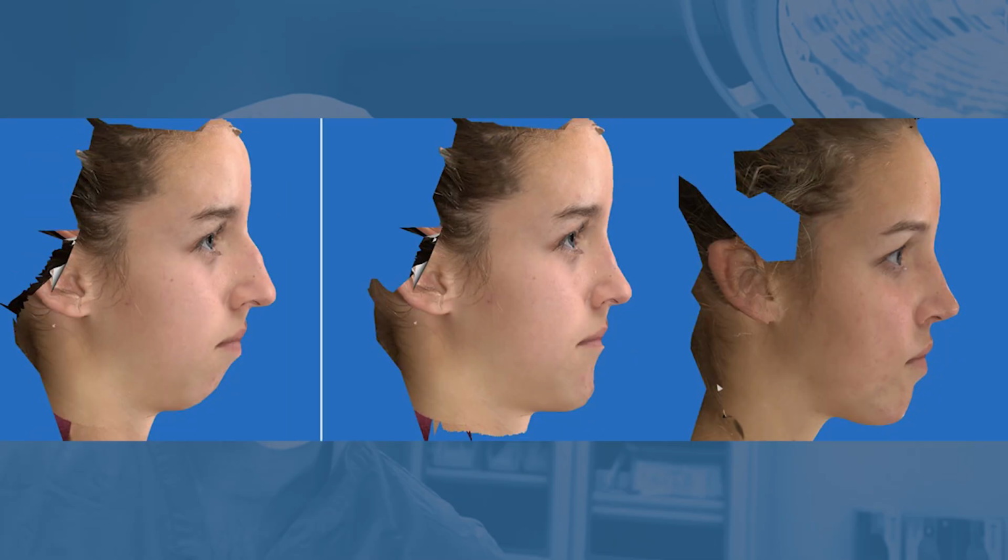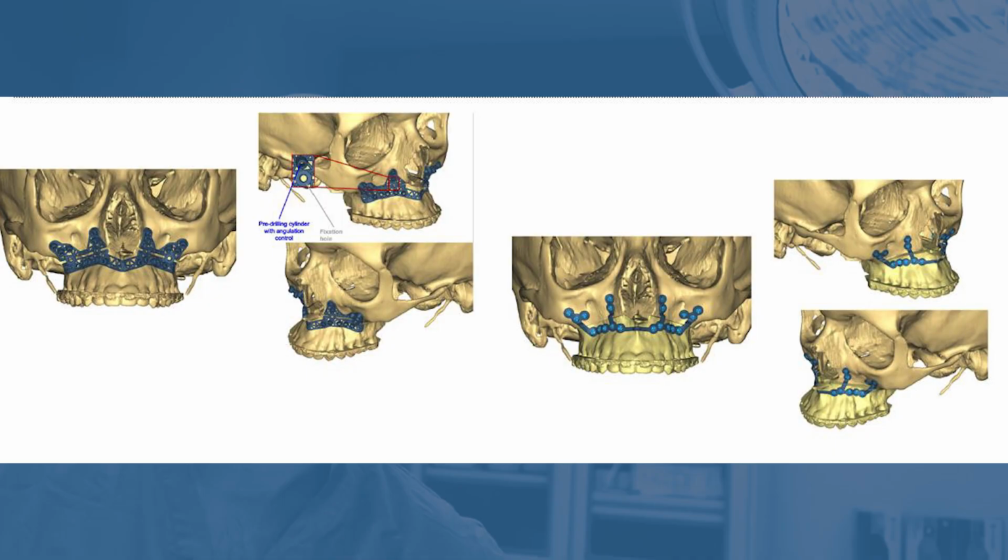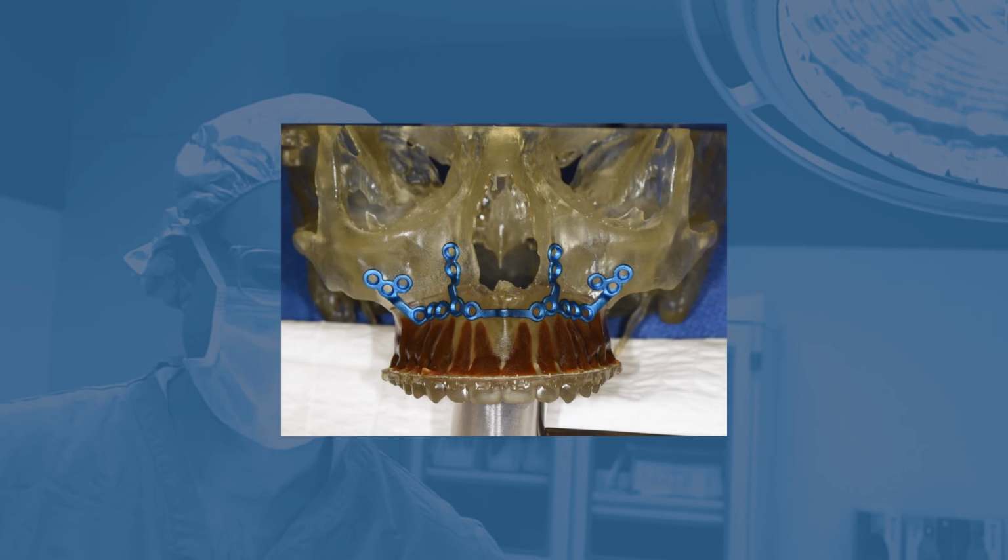We can change or alter what's called the occlusal plane, the mandibular plane. We can look at how this is impacting the nose, where we're coming to the sinuses, where the nerve is, and we can also, on the next level, move to actually designing plates and screws that can be 3D printed that, based on our final movements digitally, will help us recreate that exact movement in space.